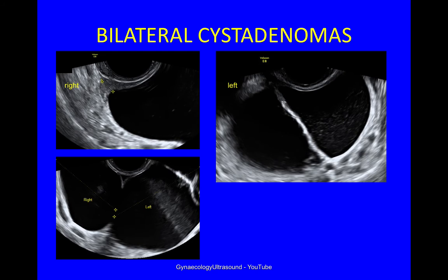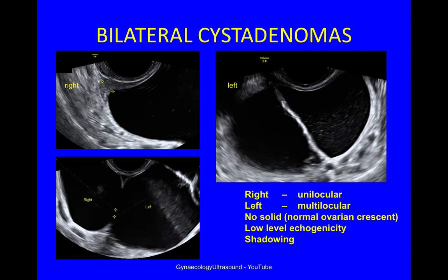Sometimes cystadenomas can be bilateral. On the right side was a unilocular cyst — a normal ovarian crescent at the periphery is not solid material. On the left side was a bilocular cyst with a little bit of low level echogenicity in one locule but anechoic in the other. In the transverse plane you can see both ovaries abutting each other and some shadowing posteriorly. These were bilateral serous cystadenomas.